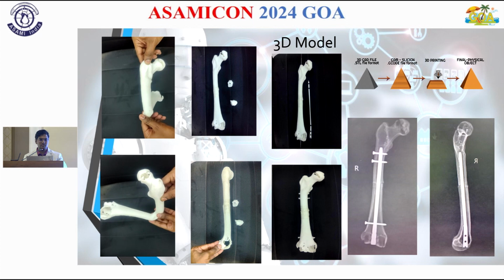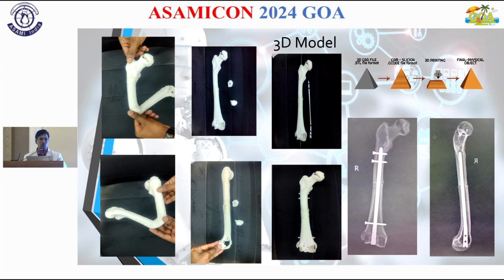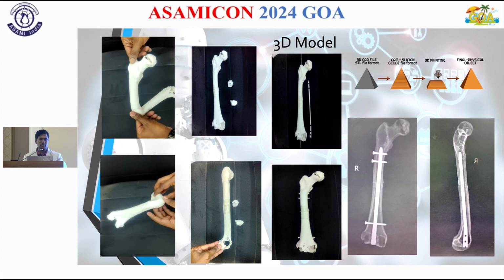The first priority for the patient would be to go for nailing, and if there is any intraoperative complication, most probably a vascular compromise, then an external fixator was also available on the table. So piece by piece, wedges were taken and the deformity was corrected. Preoperatively, we applied the nail we wanted to use to the actual size of the bone. The preoperative planning was done accordingly, and a size 25 retrograde nail was used.